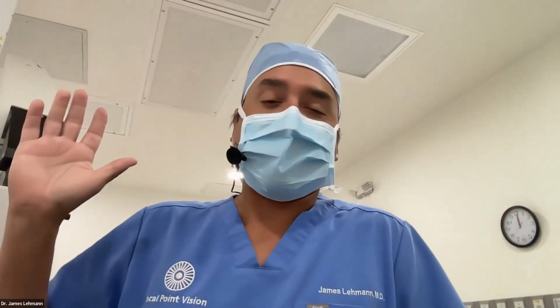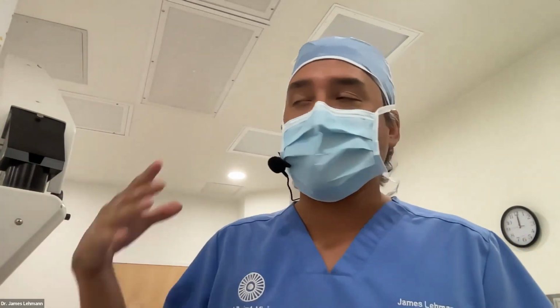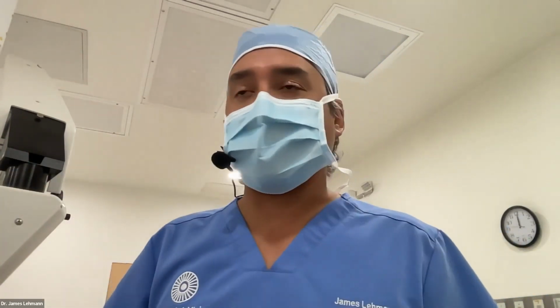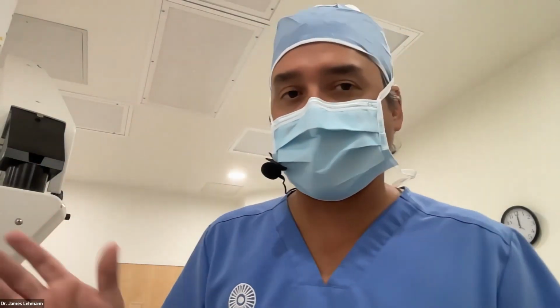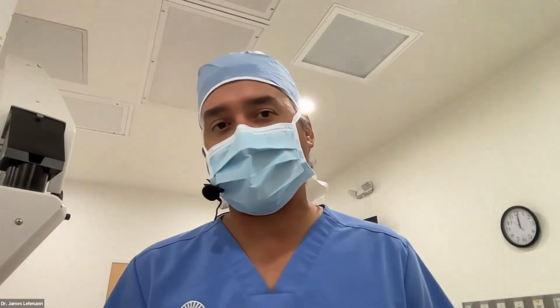Like I said, sometimes beds and ORs aren't set up in other countries to do temporal surgery. I've run into that. So if you're used to operating superiorly, you can be a great superior surgeon. It's just that honestly, temporal is easier. We just hadn't always started that way.